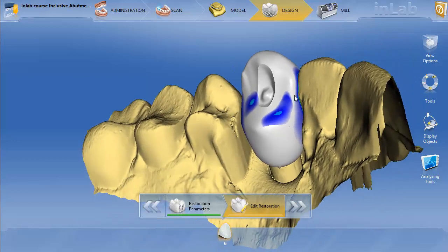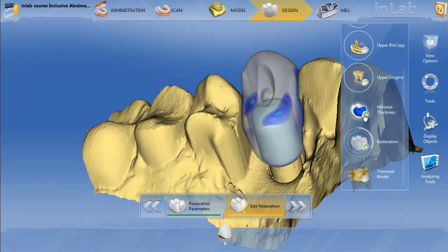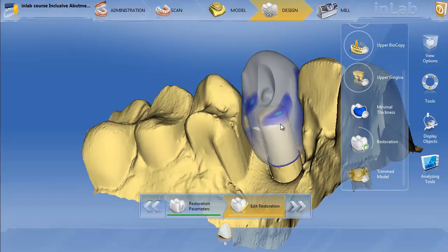I just did a full contour screw-retain restoration on the Glidewell Tie Base. If I go ahead and turn my restoration transparent, you can see where the 6mm Glidewell Tie Base is. Now what I'm going to do is show you — if for instance you had a reason why you did not want to do a screw-retain restoration.